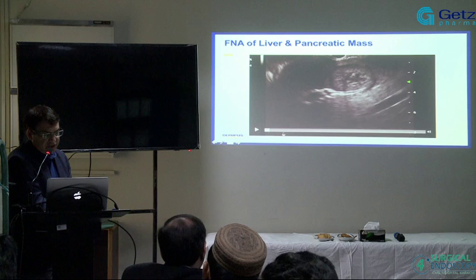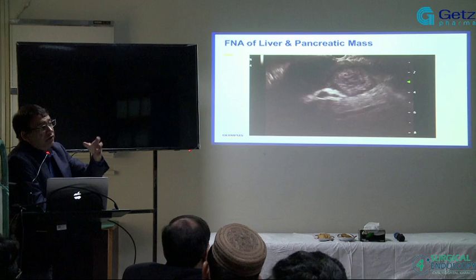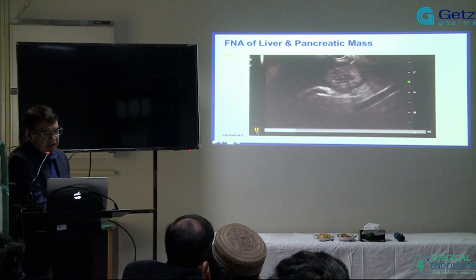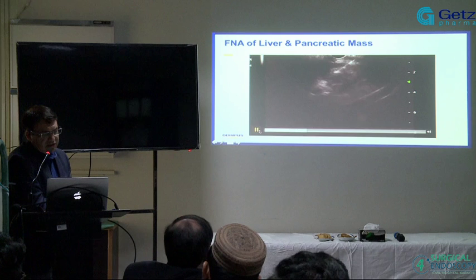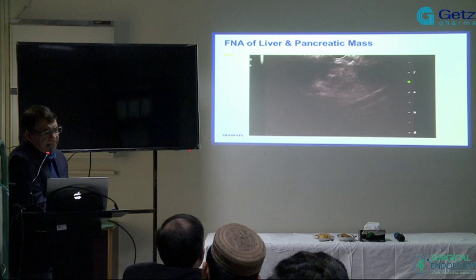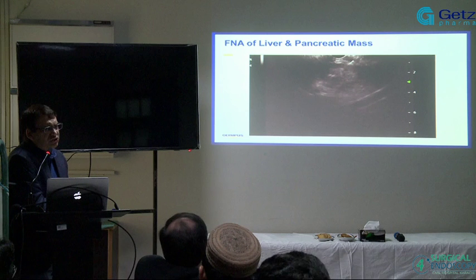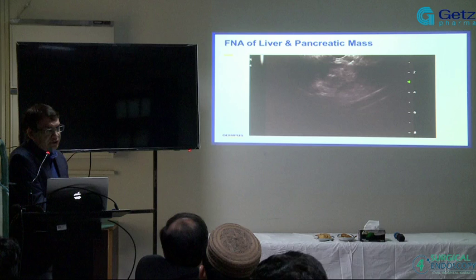Okay. So here, I think this was a patient with a pancreatic mass and also a liver met. A question earlier asked which one you would do. As I mentioned earlier, I usually end up doing both. And here, I don't know if you're going to notice that when the needle goes in, the needle is not in the center of that lesion. Why is that? I'm intentionally going to the side. It's a cystic area, and it's all necrosis. It's all dead tissue. Even though going into the center makes you feel better that you are right in the lesion, you are not getting tissue.